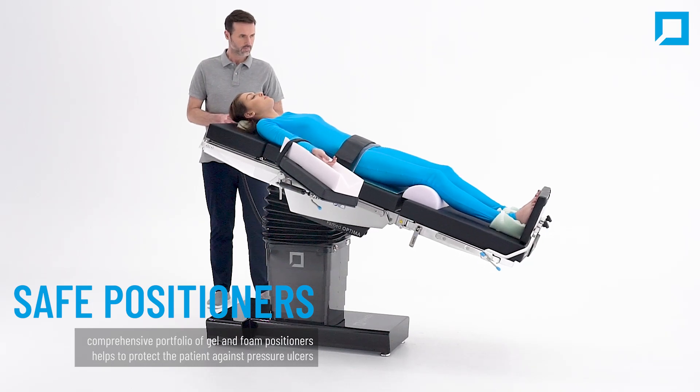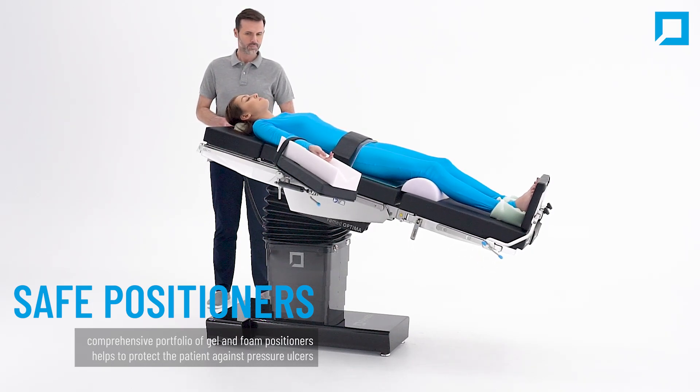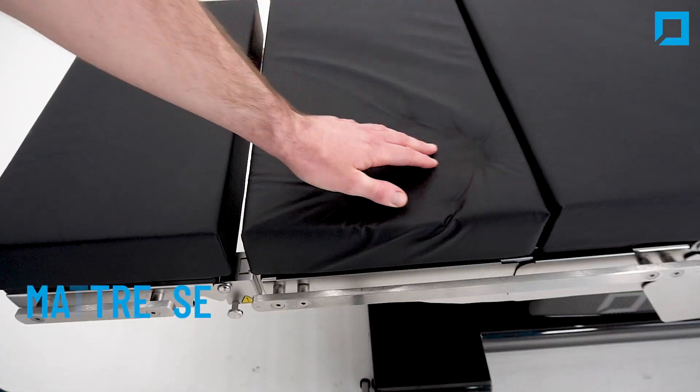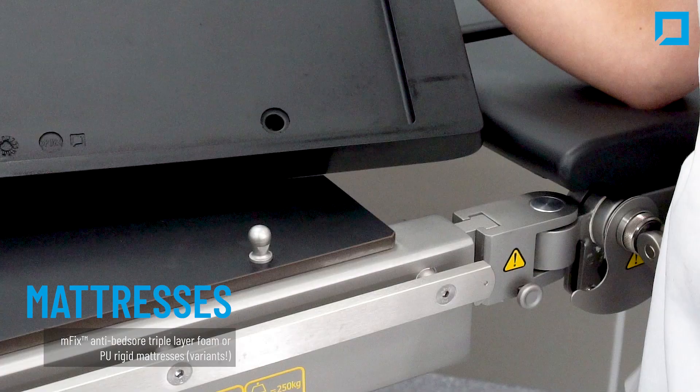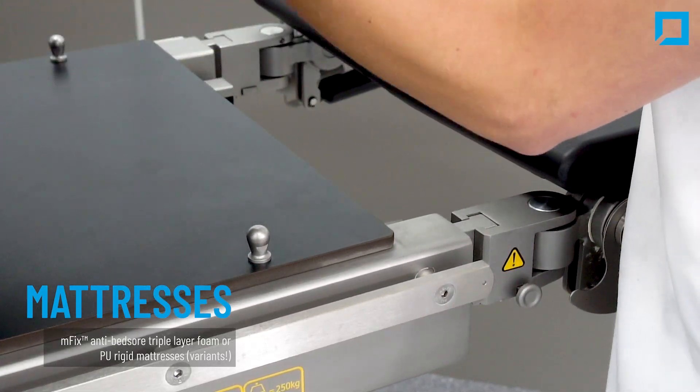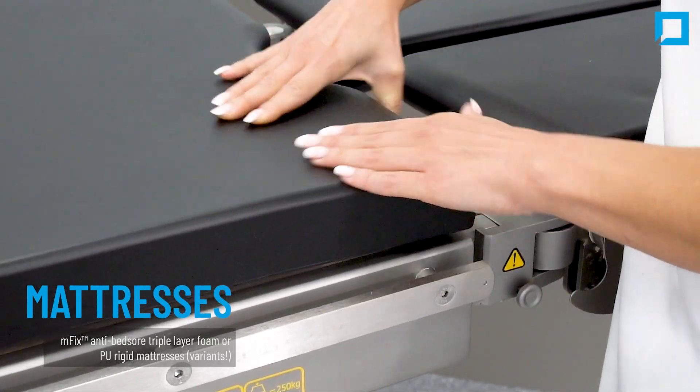Optima offers a comprehensive portfolio of gel and foam positioners to help protect the patient against pressure ulcers. Choose M-Fix anti-bed sore triple layer foam or polyurethane rigid mattresses — all Famed mattresses offer anti-bed sore properties.